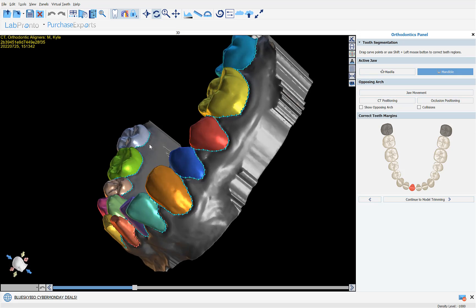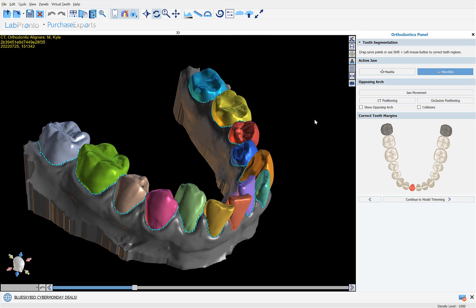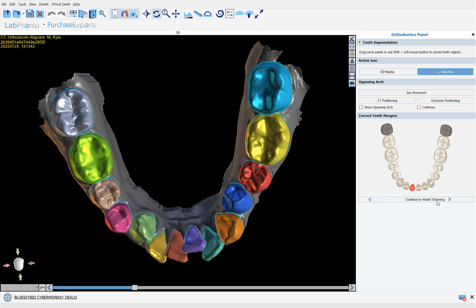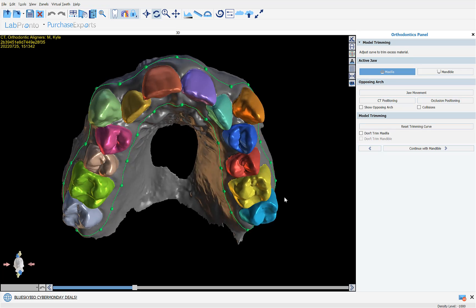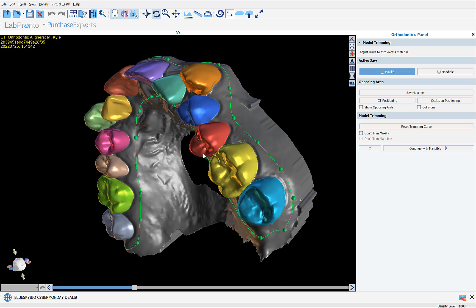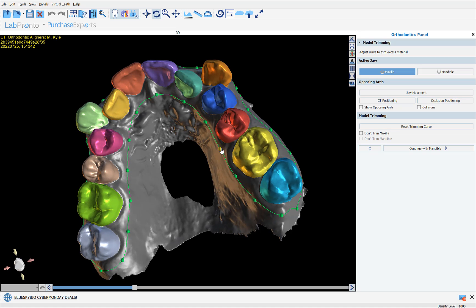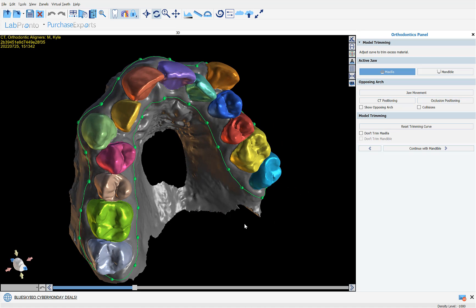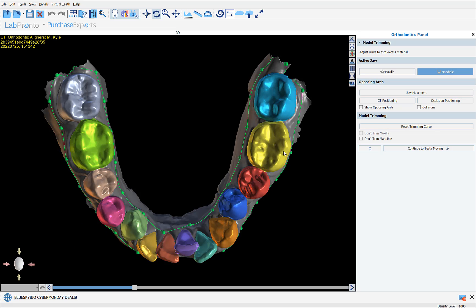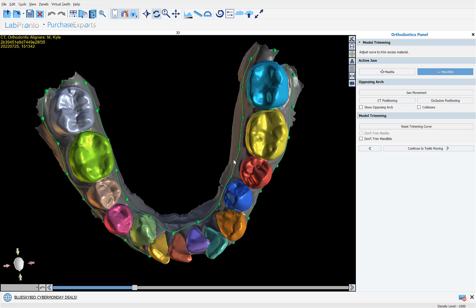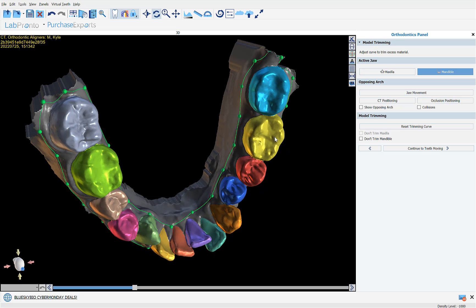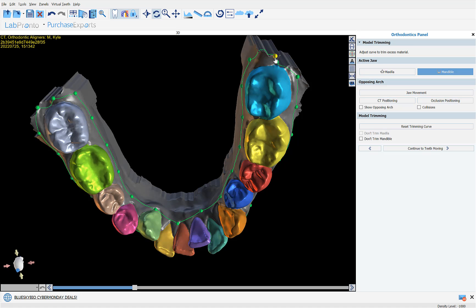Here we can review the trim curve on the mandible, make any adjustments as necessary, and then click continue to teeth moving.